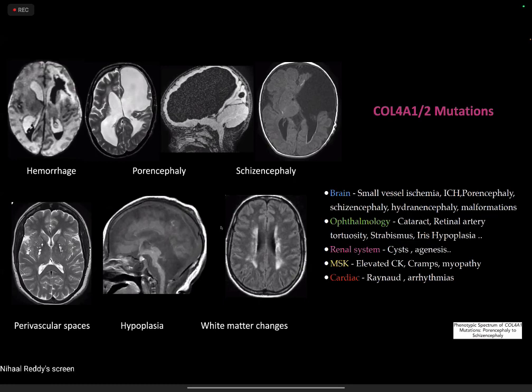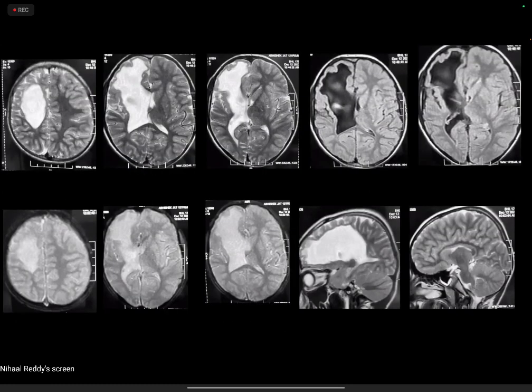No, I don't think there's another differential here with two family members affected. The clinical challenge would be that if the first child comes, you say it's a non-recurrent pathology, and you can go for another child. Is there any handle in this scan to say this could be something genetic rather than something you should investigate further?